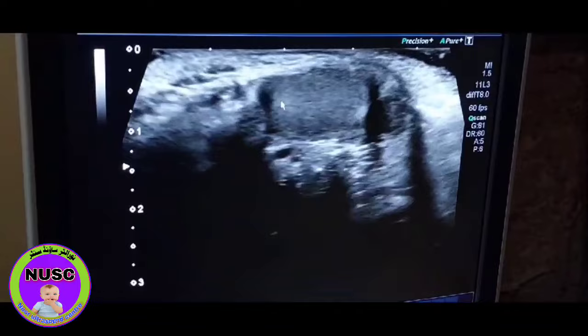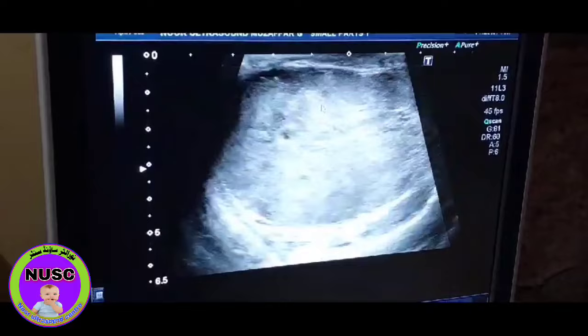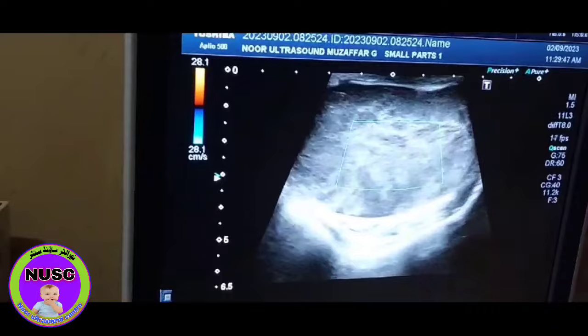But when I come to the left side of the scrotum, as you see here, this is a solid complex mass with cystic areas. Again, you can see this is highly vascular.